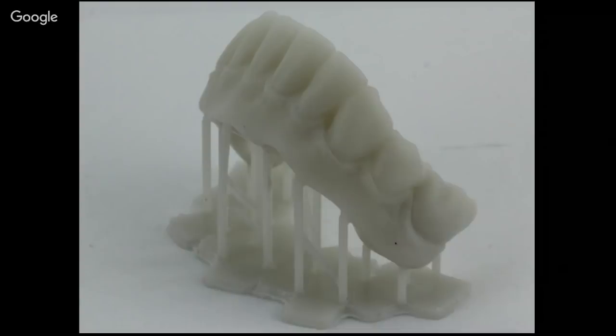And if they're going to be able to use that file, they're not going to be able to get the STLs out otherwise. So they've got to purchase the teeth for conventional processing. So if you have a pet denture tooth you like, start bugging the powers that be to submit their libraries to Blue Sky, and we'll do our best to incorporate those.